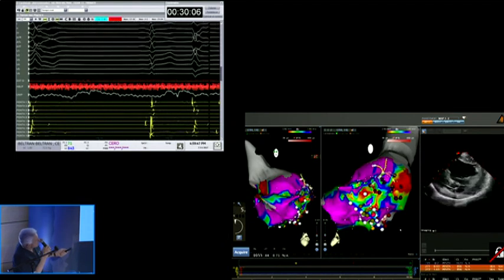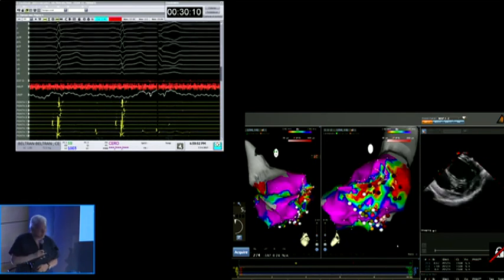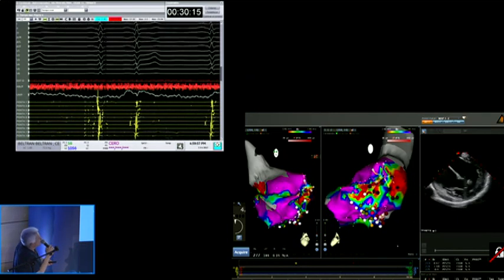I saw in sinus something. We have atrial activations. Next to that, you can actually see the sequence of delay. Yes. Okay, I'm going to undeflect and get a bit lower, to complete the map a little bit more.